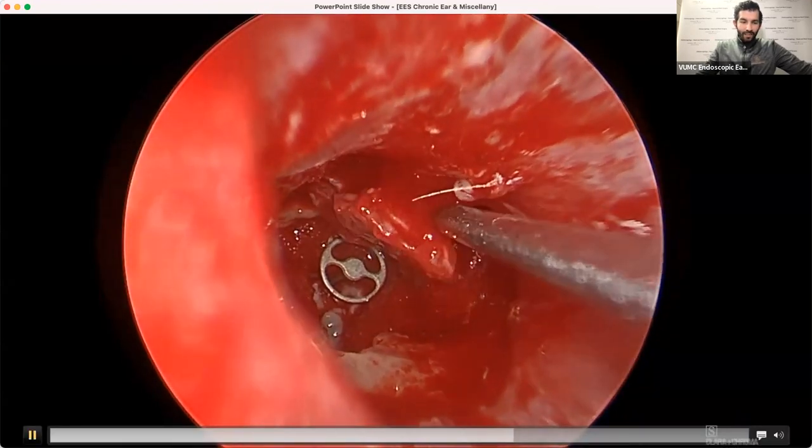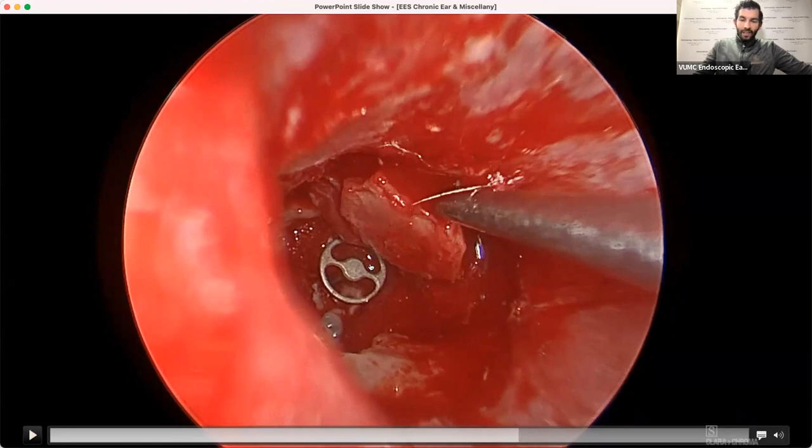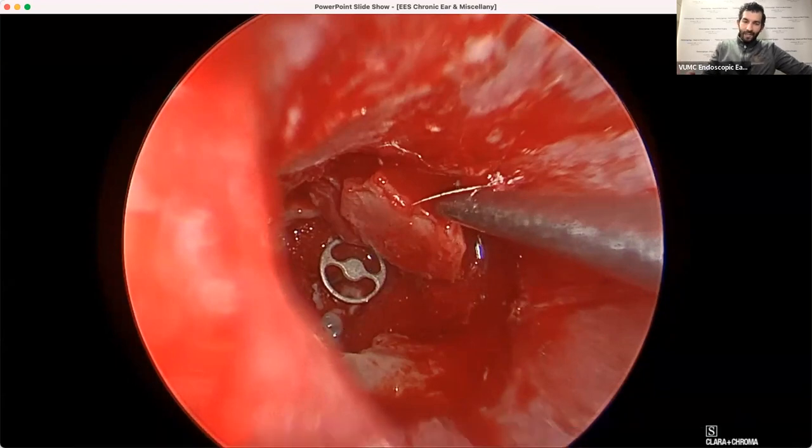In this case, I'm going to pause it because this is a really critical point. This thing was so erosive. The vestibule appeared to be eroded. And what I didn't show you, unfortunately, is that T2 hyperintense signal ended up representing basically a meningocele. This gentleman had had a translab, so it had wide decompression of his dura, including the dura of the tegmen tympani. You put your endoscope in there and there's this bluish hue, and the tumor was right up against that dura.